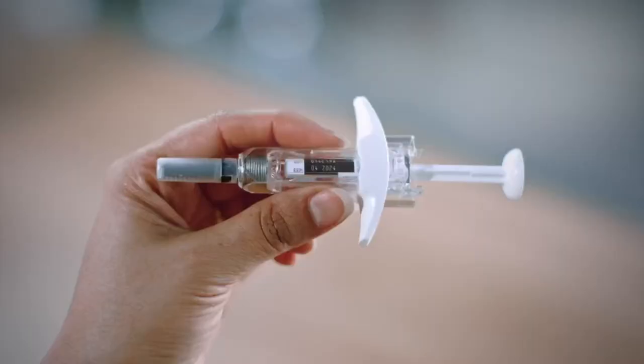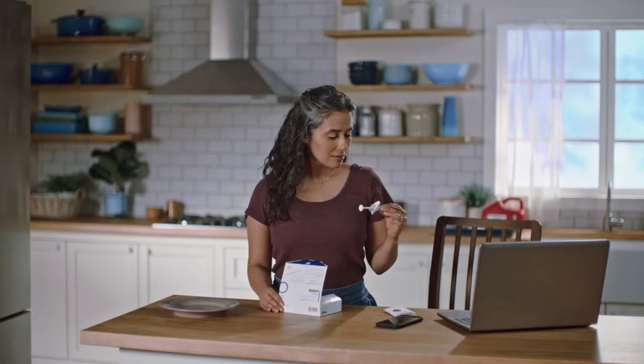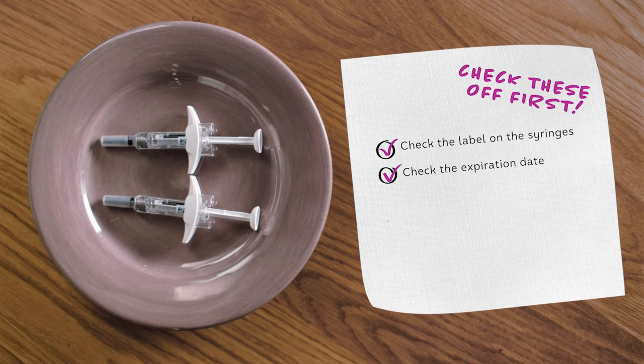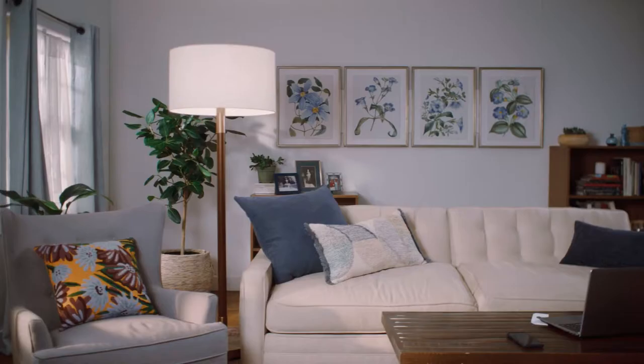Now that your syringes are at room temperature, check them for a few things. Keep in mind your syringe colors may be gray or white. Check the label and the expiration date, and make sure the syringes are not damaged in any way. Look through the syringe's viewing windows. The liquid inside should look clear to slightly pearly and be either colorless or pale yellow. It should not look cloudy, discolored, or have particles. If you have any questions about whether the syringe is okay to use, do not inject either ADBRI pre-filled syringe. Give your healthcare professional a call and let them know, and call 844-MY-ADBRI to speak with an ADBRI nurse advocate.